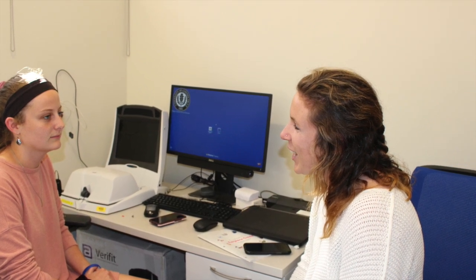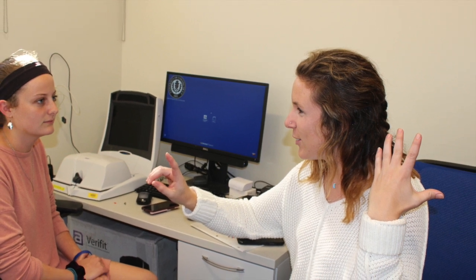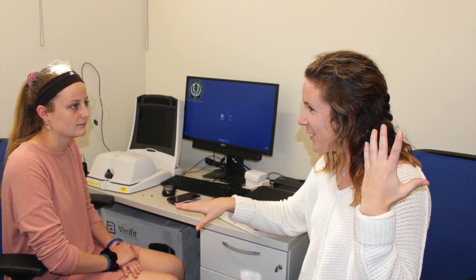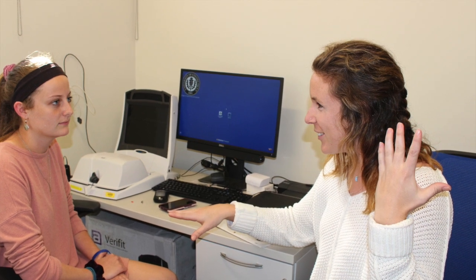In order to have patients effectively utilize this feature in real-world settings, counseling is vital. You should instruct the patient to sit with their back to the noise and to face the speaker that they want to hear. Directional microphones only give benefit if there is separation of the speech and the noise.